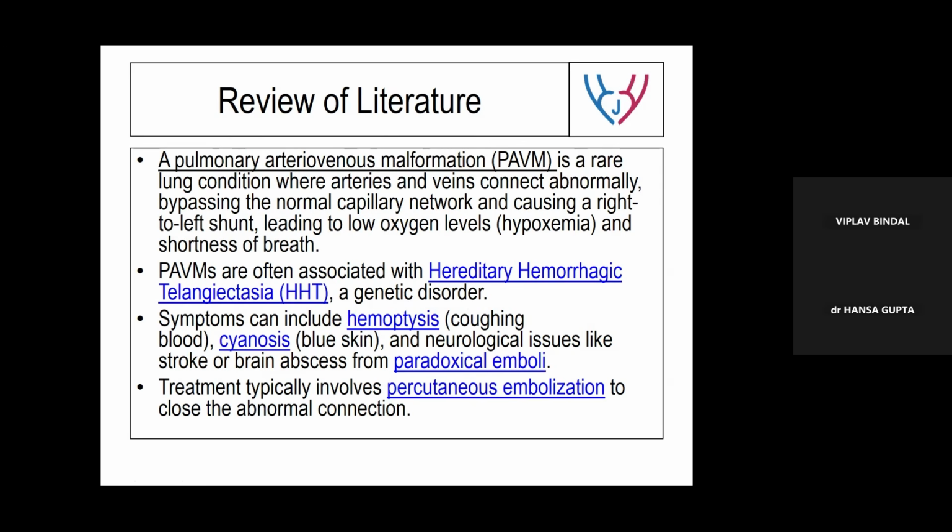And when that infective pathology disappeared, this flow disappeared completely. And we could make a diagnosis without any CT scan. We did not get the CT scan done for this patient. So this is the power of echocardiography, especially when we are talking of.